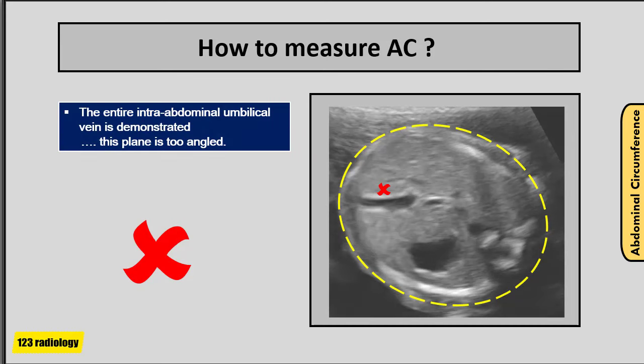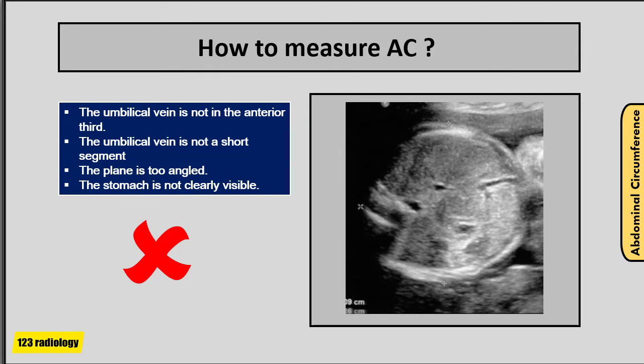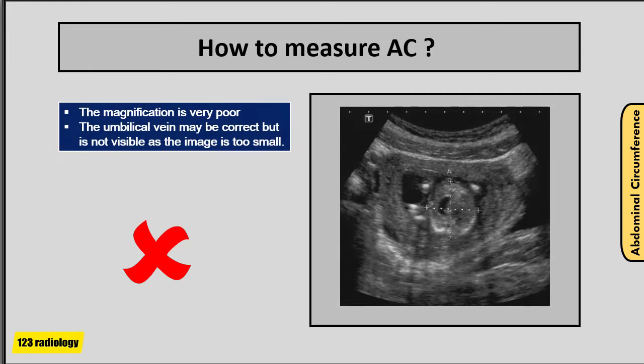Incorrect examples of abdominal circumference measurement: in the first, the entire intra-abdominal umbilical vein is demonstrated, meaning the plane is too angled, leading to incorrect estimation. In the second, the umbilical vein is not in the anterior third and is not a short segment — again the plane is too angled, and the stomach is not clearly visible. In the third example, magnification is very poor and the umbilical vein is not visible as the image is too small — all leading to incorrect abdominal circumference measurement.